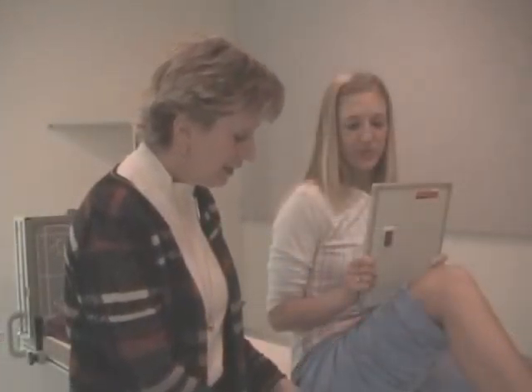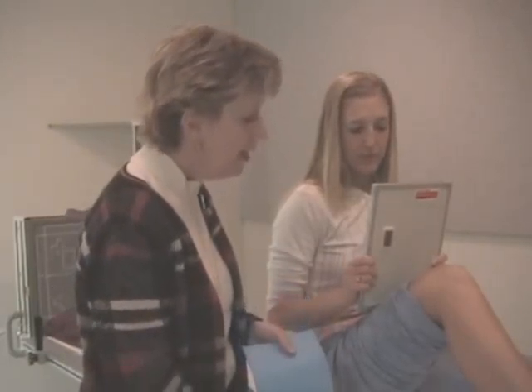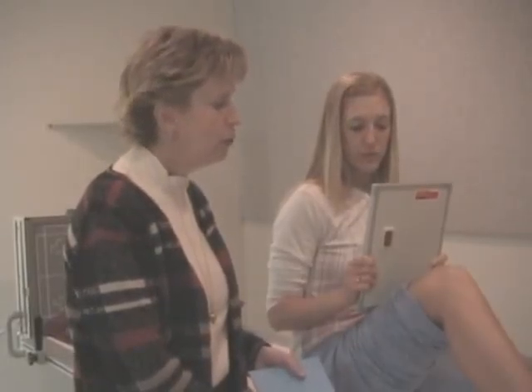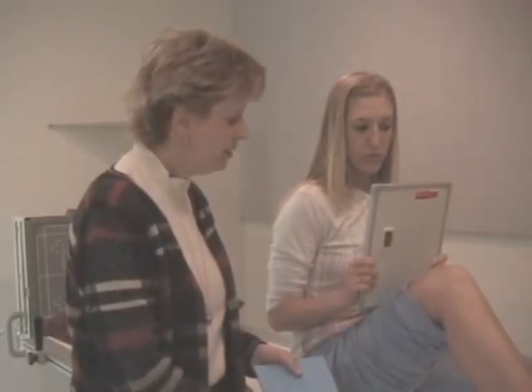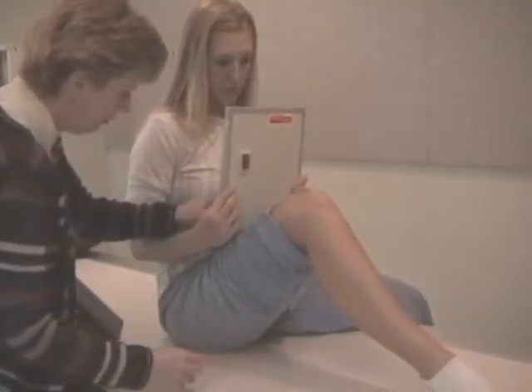We've got Kristen set up for a right projection of her patella. There's many multiple ways that you can demonstrate the patella. First of all, we've ruled out a fracture before we've had the patient bend the knee to this extent. I'm going to show you where we put the lead strip, and then if it falls down, for the camera's sake, I won't worry about it, but I've protected her reproductive organs.